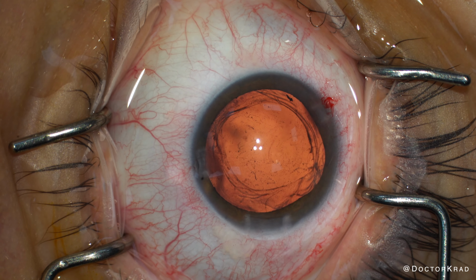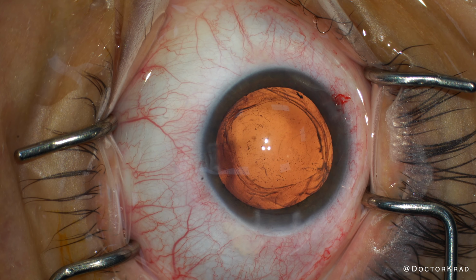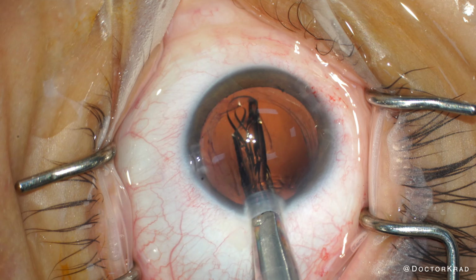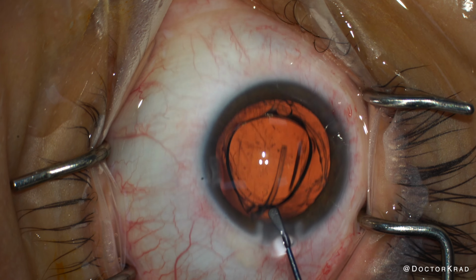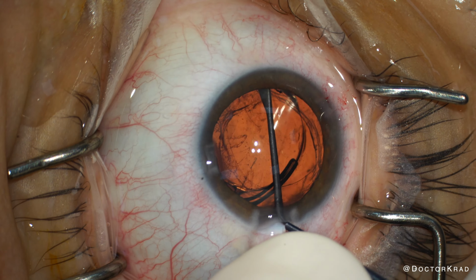And so I'm going to very carefully look for the CTR, but if I don't see it, as long as it's not partially in the bag and partially out, I think the patient will do well. And since I don't see it, I think it's time to put the replacement lens in the bag. Since a YAG capsulotomy was not performed and we didn't harm the posterior capsule, it makes this sort of exchange fairly routine. After insertion, I see this little sterile filament, so I just don't want to leave that. I take that out.